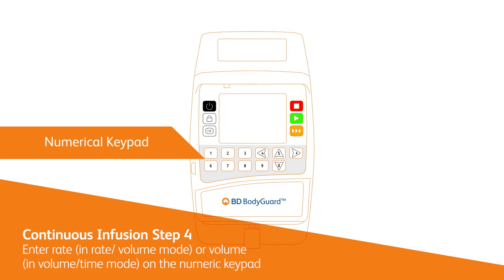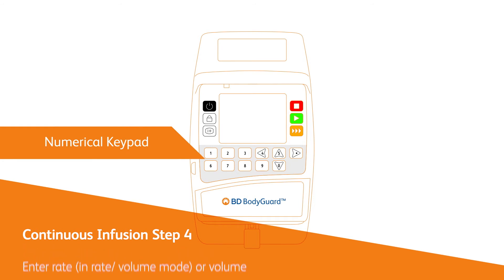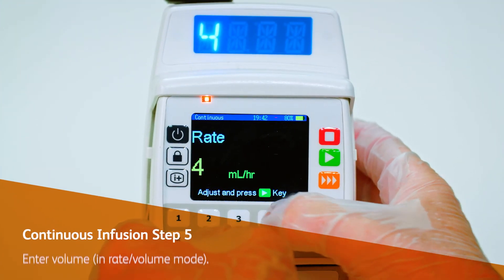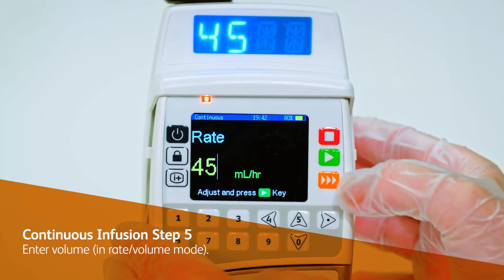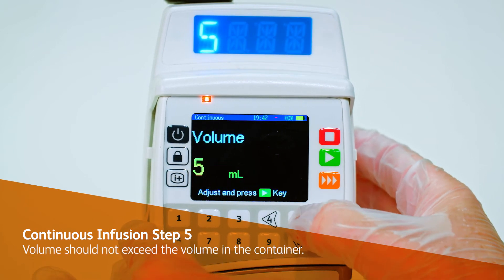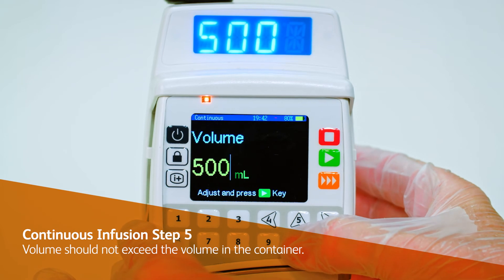Enter the rate in rate-over-volume mode, or the volume in volume-over-time mode, on the numeric keypad. Confirm the setting by pressing the OK key. Enter the volume in rate-over-volume mode or the time in volume-over-time mode. The volume values entered should not exceed the volume in the container.